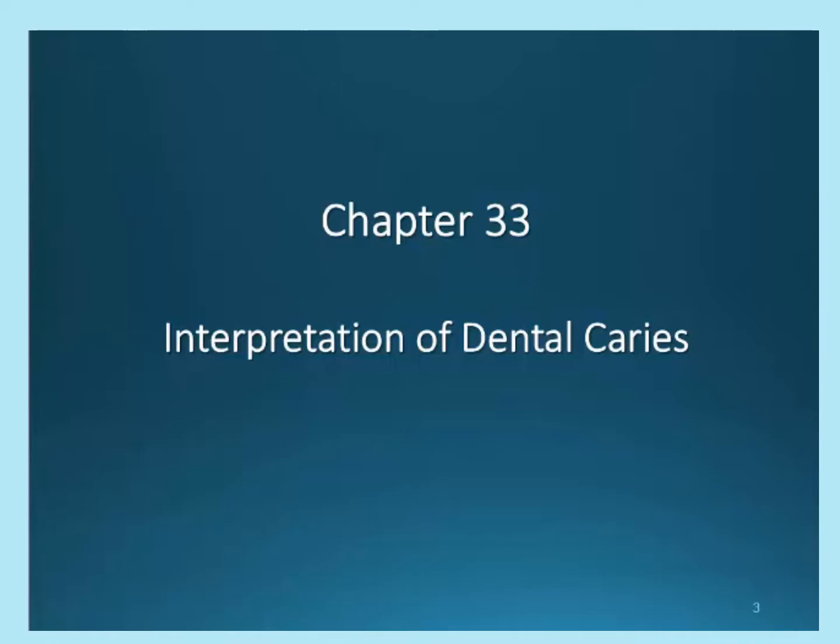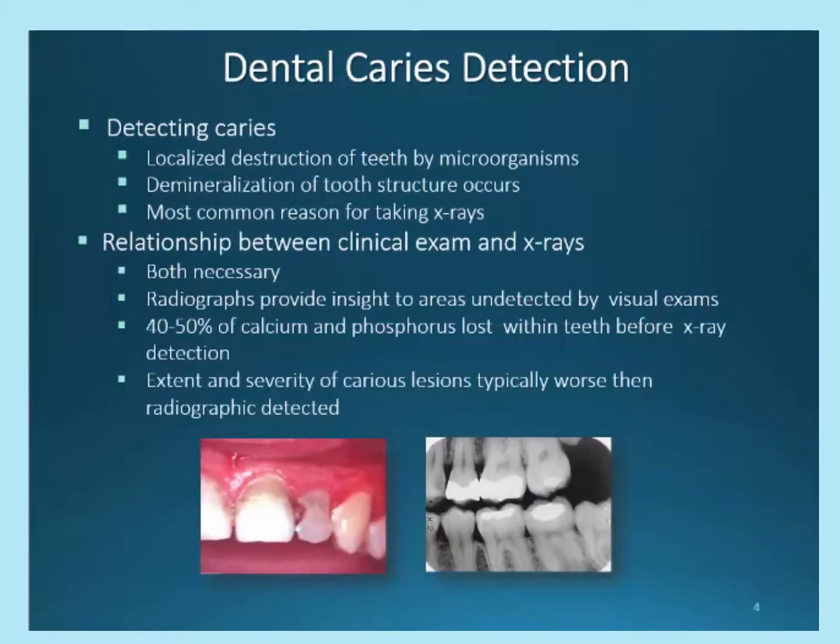Keep in mind as you train your eye to detect caries when radiographs are taken. For this lesson, in other courses, you have already been instructed on how to visually see decay and the microorganisms that cause this destruction. The demineralization of tooth matter can be seen in dental radiographs. However, destruction is not visible on onset. Identifying these lesions at their earliest point of visibility on radiographs is the main reason for periodic radiographic exams.